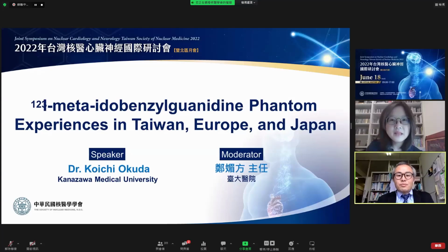Thank you so much for the important question. As shown in my presentation, some researchers have reported on HMR in MIBG SPECT imaging instead of planar images. And I had experiments to quantify the HMR in SPECT images.